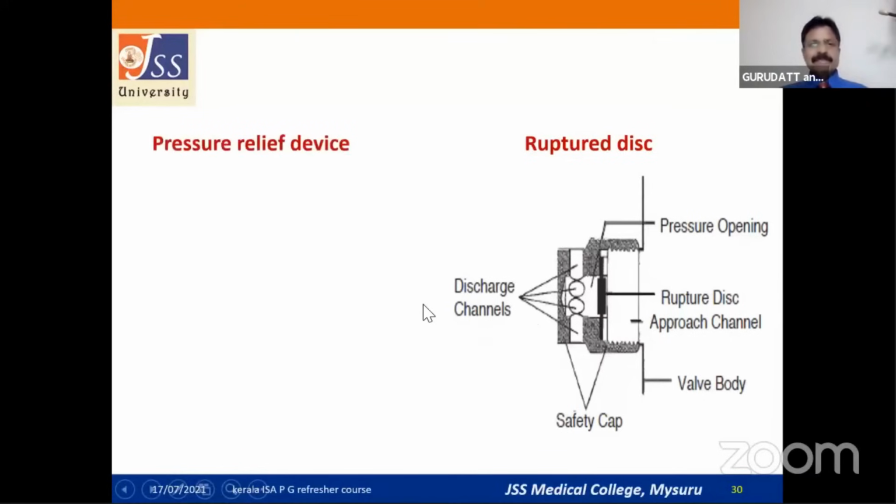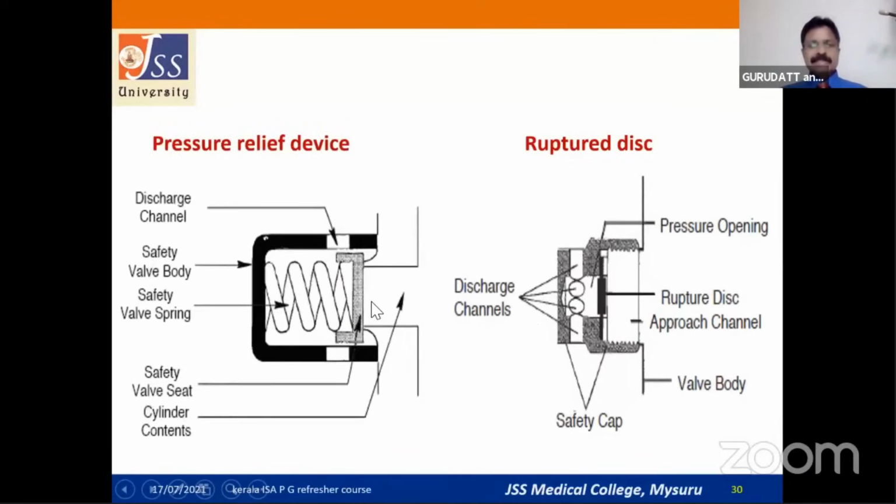The third type is the pressure relief valve. It's like the pressure cookers in our kitchens.